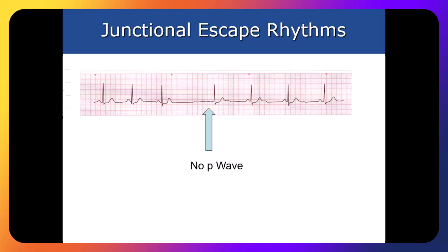Because in essence, you could make an argument that that looks kind of like sinus block because we only have one impulse that we're missing. Or potentially you could see a sinus arrest with the whole depolarization picking up with a junctional escape beat as well. That's a good way to look at it. Excellent. Anybody else?